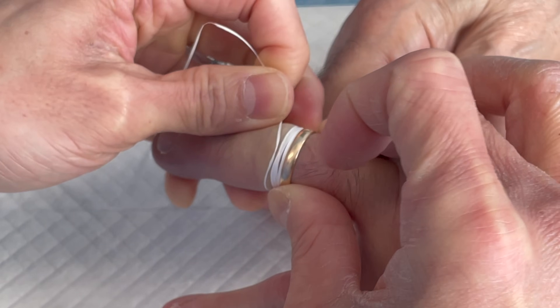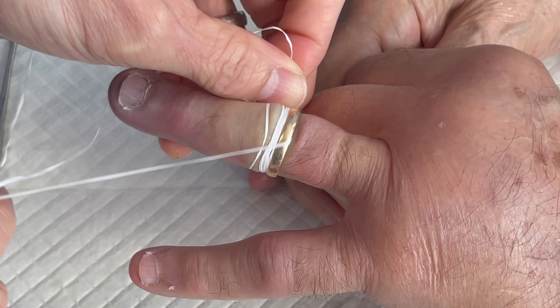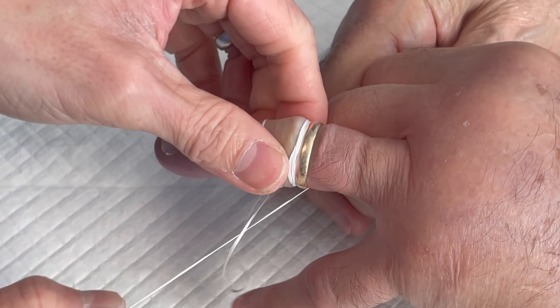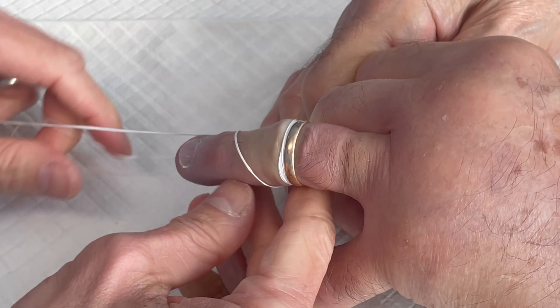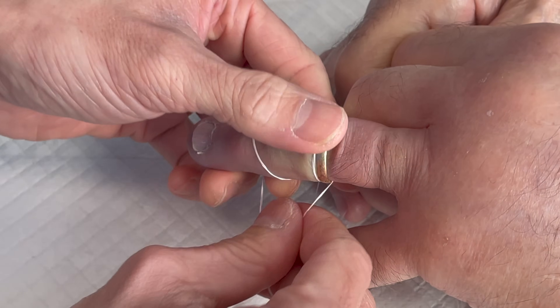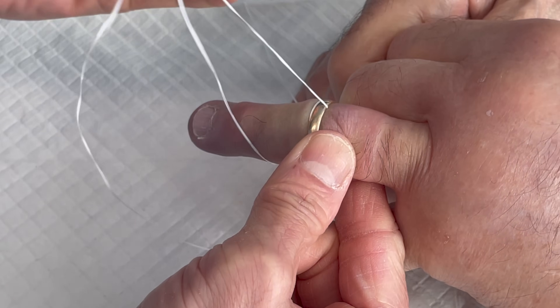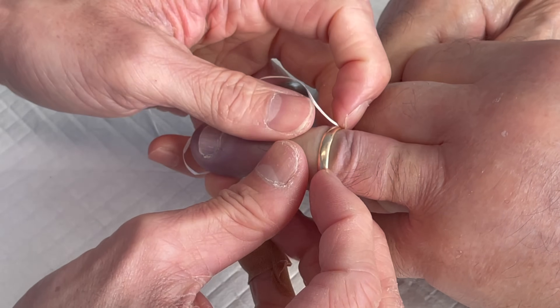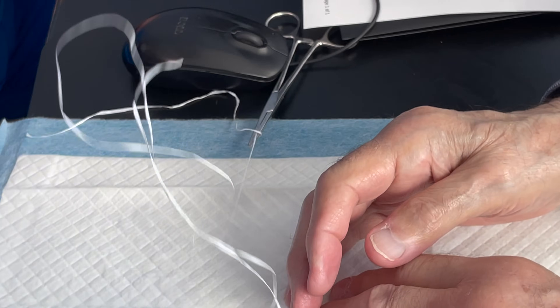I think this technique is great and hopefully you enjoyed it. It's probably useful for anybody who works in an emergency room, an operating room, who is a hand surgeon, or even any orthopedic surgeon who works in the upper extremity, because you're going to have patients who get swollen and require their rings be taken off. Even if you have a ring cutter, this is probably a good option — and you can see here we popped the ring off and it worked well and the patient was super happy.